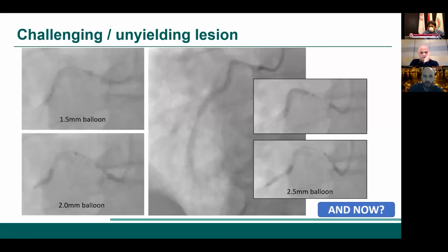This is one case. Have a guide extension inside, you can be extra careful and advance the guide extender itself through this 90-degree arch, and/or come out only with the rota head through the guide extension device when it's already in the downward section of the vertical RCA.